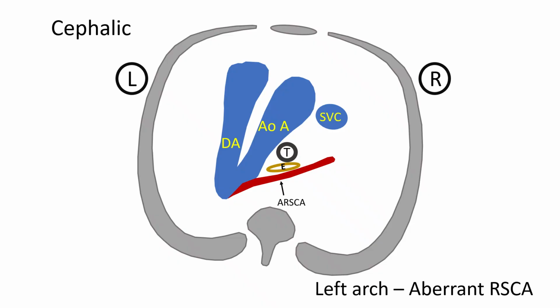So the other most common thing that we see is an aberrant right subclavian artery where you have a normal left arch and left ductal arch, but then as you saw in that last case prior to the total veins case, you can see how that aberrant right subclavian artery travels in this angle behind the trachea and esophagus, and the trick is to get this aligned in a way where you can have that color signal flowing almost in plane with the plane of insonation. Will give you the best view of that.